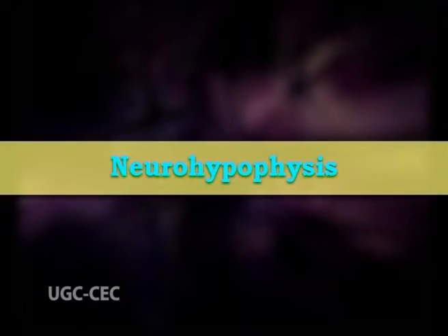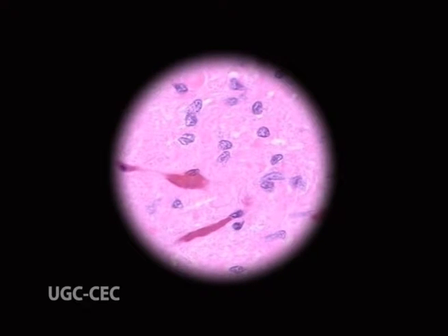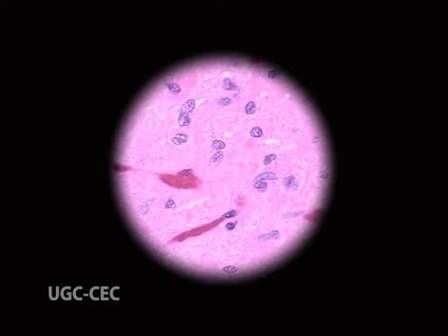Neurohypophysis. At the microscopic level, the pars nervosa of the neurohypophysis shows a very fibrous structure with some sparse cells among the fibers. Using hematoxylin eosin stain, these cells are seen as irregularly shaped cells with oval shaped nuclei, called the pituicytes.